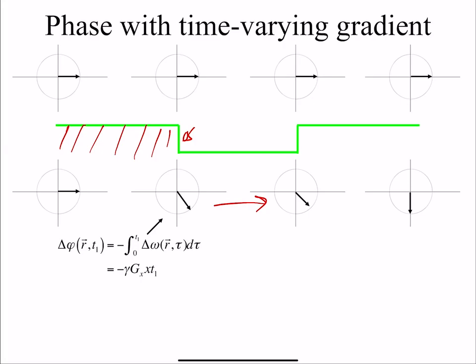So the relaxation is, let's say T2 relaxation is 100 milliseconds. So we're going to assume we can do all this stuff in 5 milliseconds, which is actually practical. Okay, so we can actually go through a line of k-space in 3 to 5 milliseconds. So that's much less than 100 milliseconds, so we can ignore the T2 relaxation. This is different. This is basically saying that it's going to be advantageous for me to get through k-space. I'm going to turn the gradients on and off.